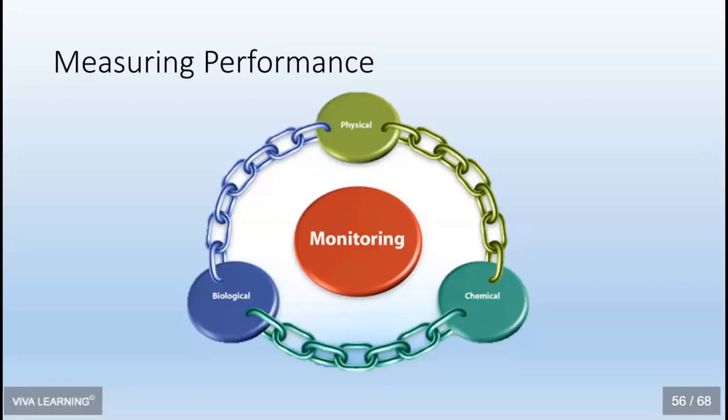Those physical monitoring values do not guarantee sterilization, nor does the turning of the chemical indicator, because remember, chemical indicators are evaluating specific parameters of the sterilization cycle. Some of them are going to be monitoring like sterilization tape. The only thing that evaluates is heat.